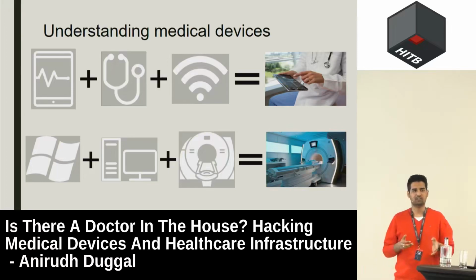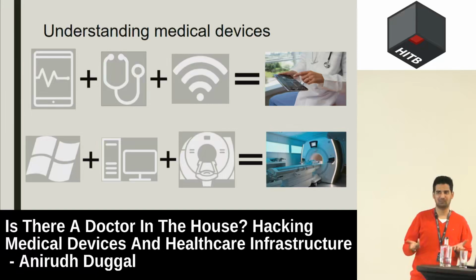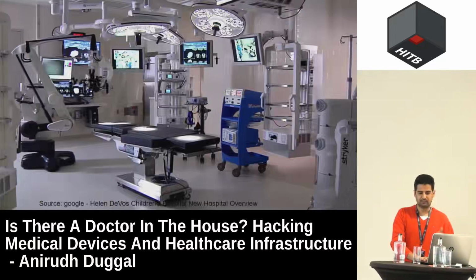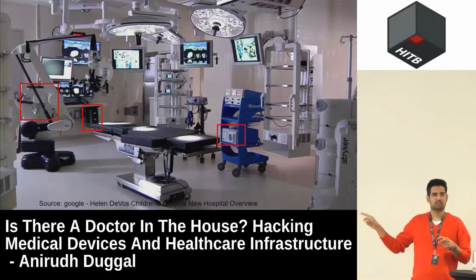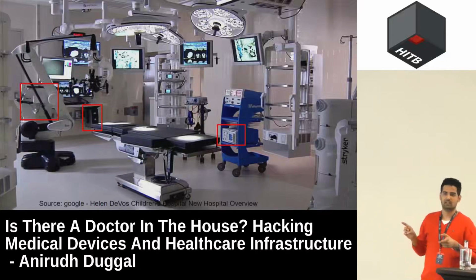That is the time when you dig in, use Nmap, and you'll realize that it's Windows NT or Windows 2000, whatever. So that's it. Now, what does this tell us? This tells us that if you look inside a hospital or an operation theater, these are the CPUs that are there. So these are off-the-shelf components that you can attack, right?